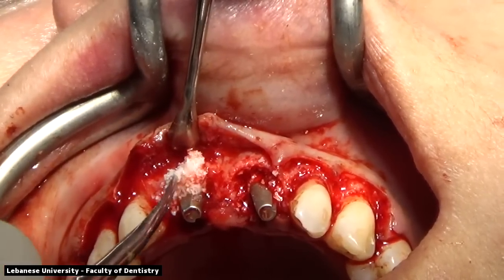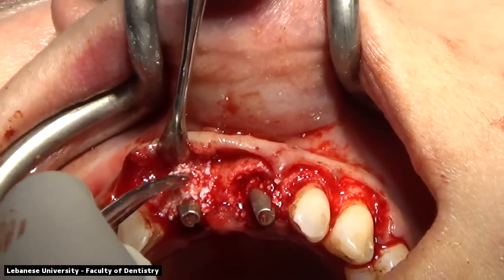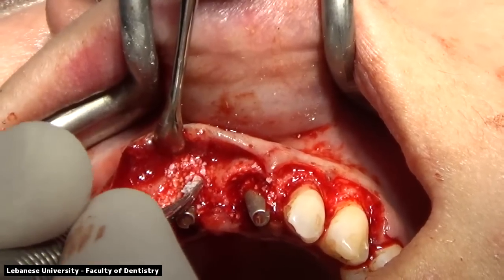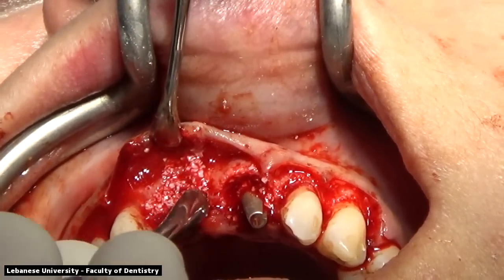There is no need to overpack and overcompact these bone particles because overcompaction will lead to suffocation of the blood supply at the site. So we try to place it as neatly as possible and as loosely as possible.